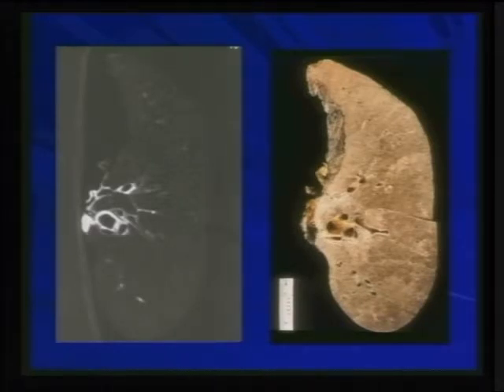If you try to take a scan of the specimen itself, again, that's the same thing that you're going to recognize, this very vague blending of tissues that represent the supporting connective tissue, and then some of the vessels and some of the bronchi coming from the center of the chest, the hilum, and branching out toward the periphery of the lung.